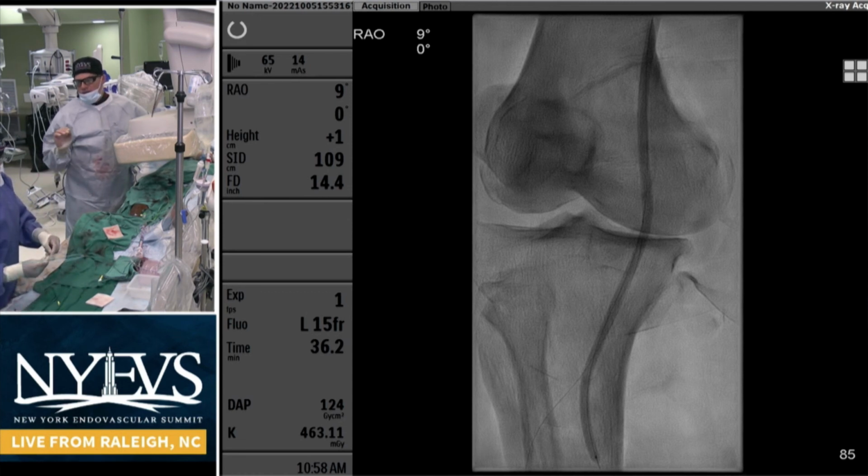Let's start from... So always place your Supera first from above, and then lay your coronary stents in, and you can lay them inside the Supera. You can lay one from above and one from below.